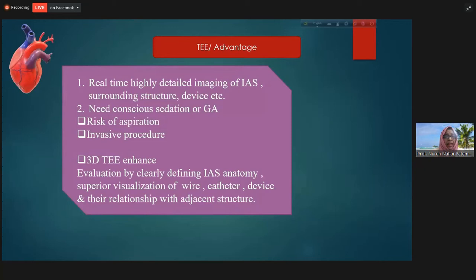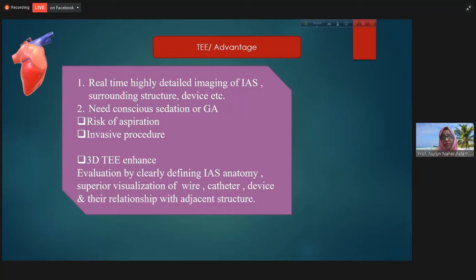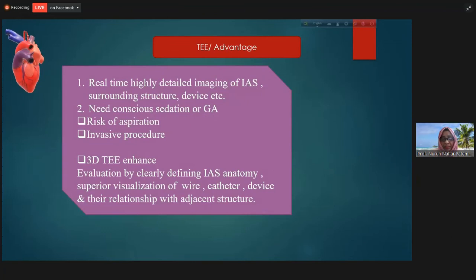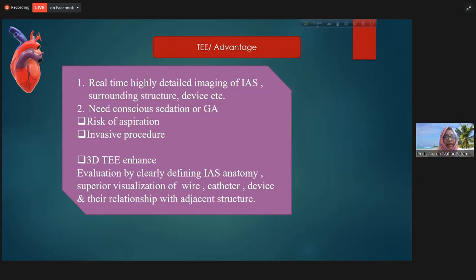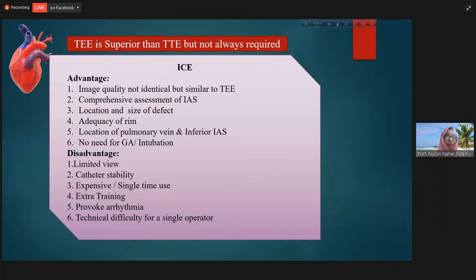Transesophageal echocardiography provides real-time, highly detailed imaging of the interatrial septum. Even catheters and devices are clearly visible with this modality. However, it needs conscious sedation — especially general anesthesia in children — with a chance of aspiration, making it an invasive procedure. Two-dimensional TEE can be enhanced further by three-dimensional imaging, which helps for evaluation of IAS anatomy and visualization of wire, catheter, and devices and their relationship with adjacent structures.